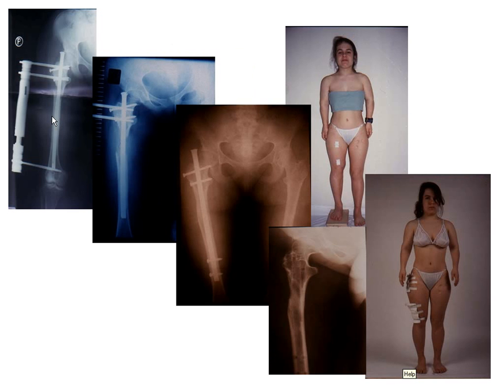Here you can see some patients which we treated. This is the application of the rod, external fixation, and osteotomy is here. We can make distraction, and when we have made the desired distraction, in this case 4.5 centimeters, we lock it distally and take the fixator away. So the application of the fixator takes 45 days. That's enough for the patient, so it's quite good for them.